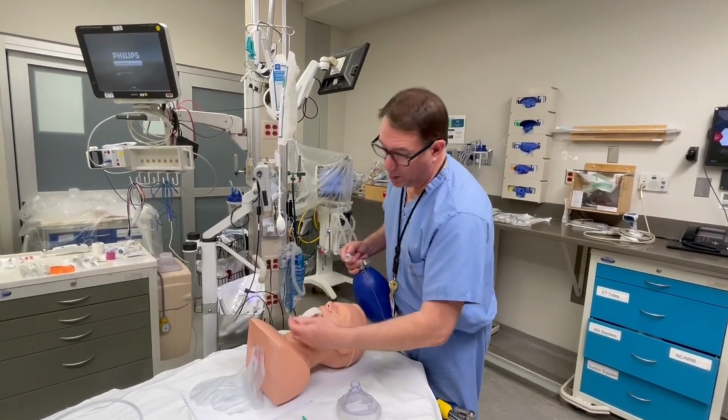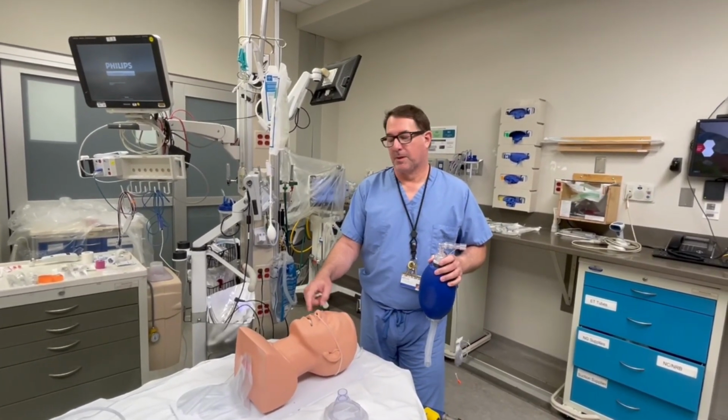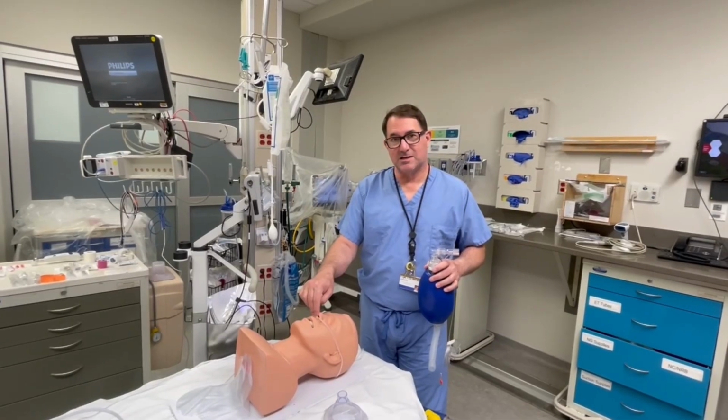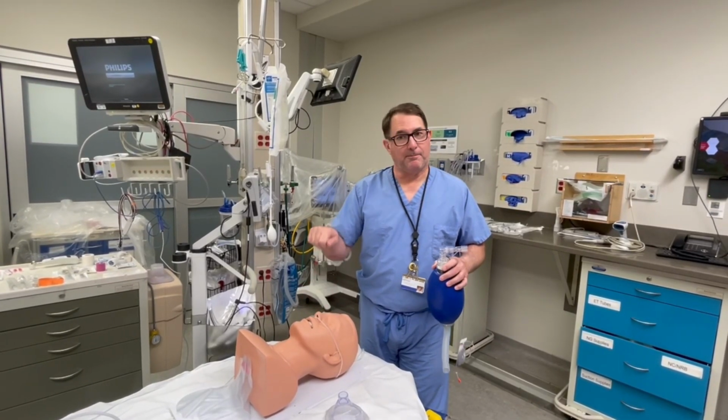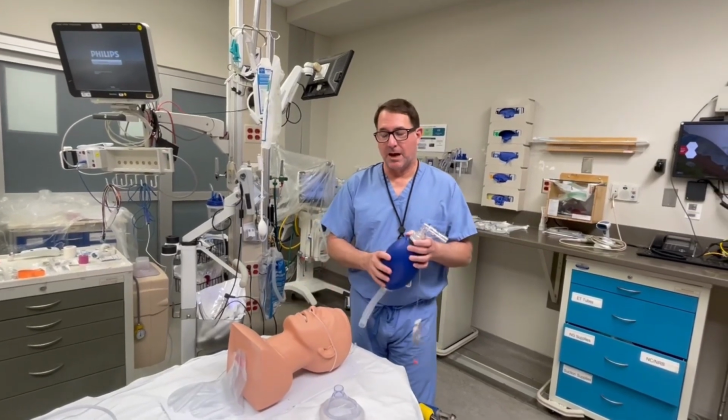So, in closing, one other little thing. Prongs. If we're in this situation right here, these things got to stay on. It's high flow, 40 liters a minute. This is an absolute lifesaver.